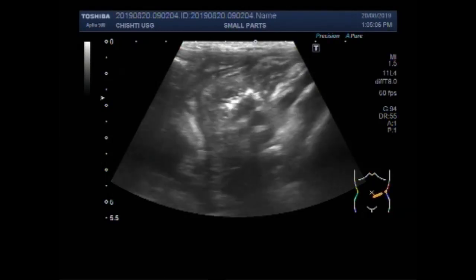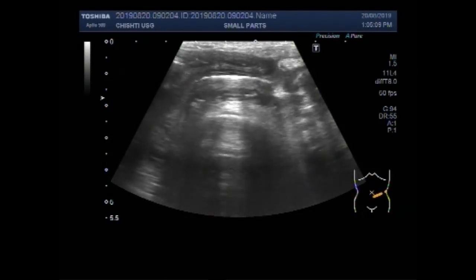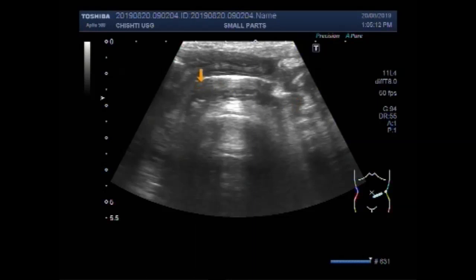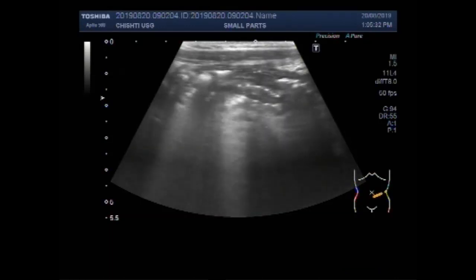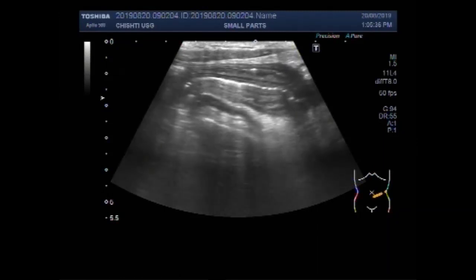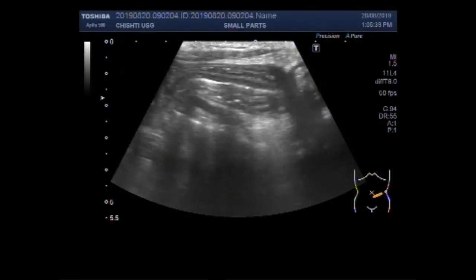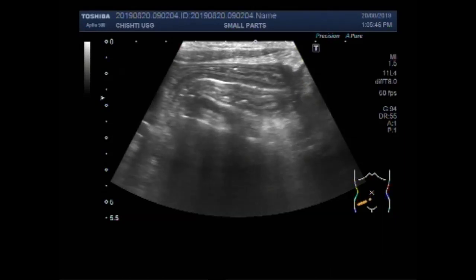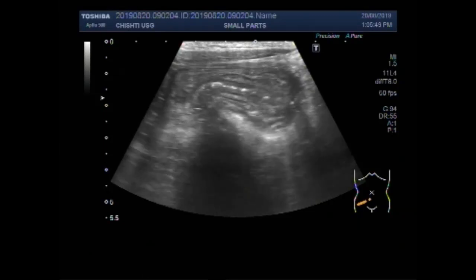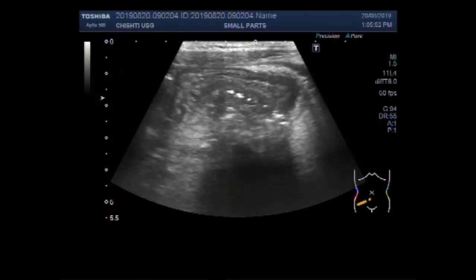And this is the inflamed gut. You can see the inflammation in the gut loops in the right fossa. The affected portion has a very narrow lumen. You can see the walls of the gut loops are thickened, inflamed, and the lumen of the gut is narrowed.